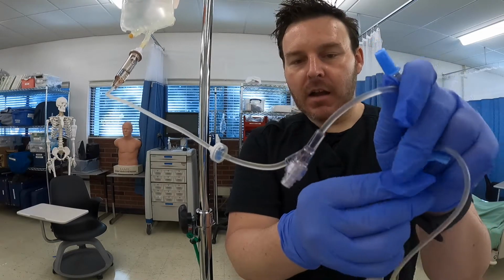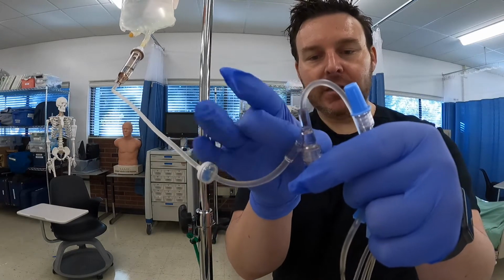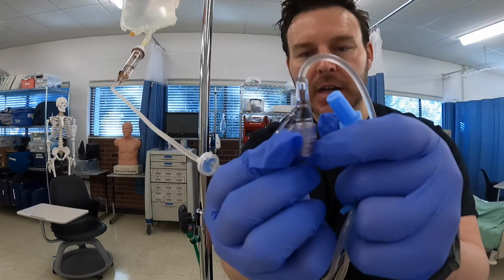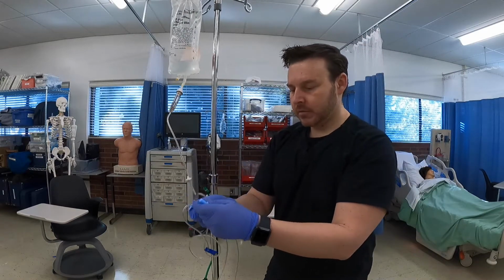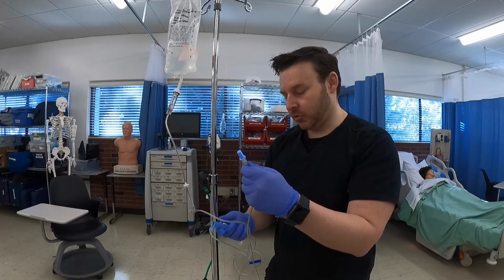Now, I like to flip them upside down like this, because sometimes the air bubble will get trapped in there. And so then I'll kind of flick it, and then we created a slight little air bubble there, right? And so we want to flush that out, continue to flush it. So I'm just going to step back a little bit here. And again, I'm holding this to make sure I have control of it.